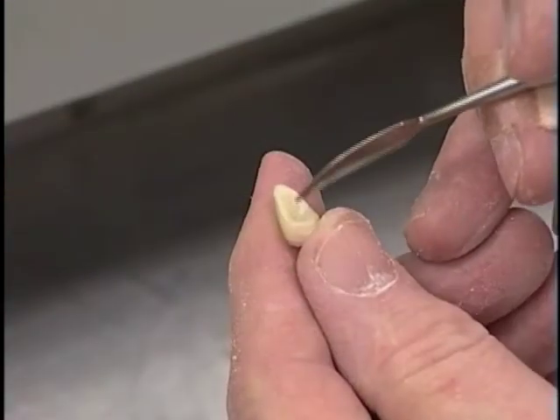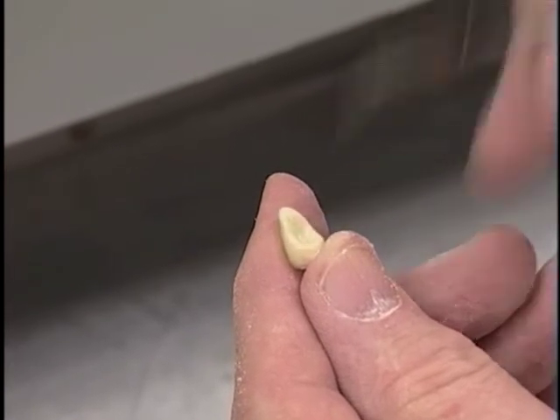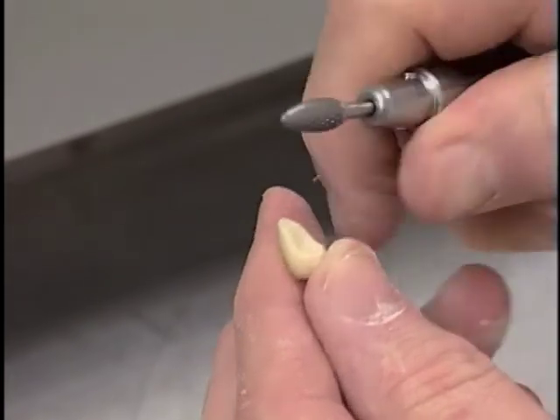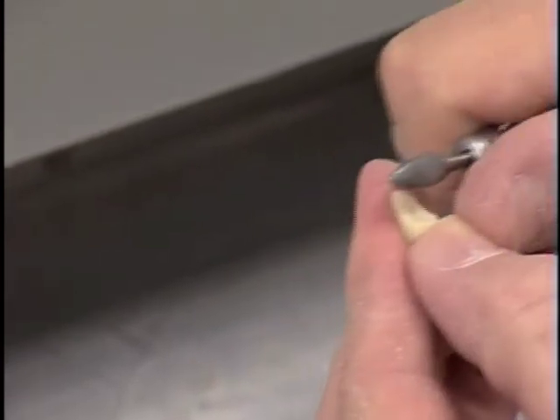We noted from where the interference was in the wax that it was this general area of the tooth that needed to be trimmed, so we just take a slow-speed handpiece and an acrylic resin burr. And don't drop the tooth as I did that one.